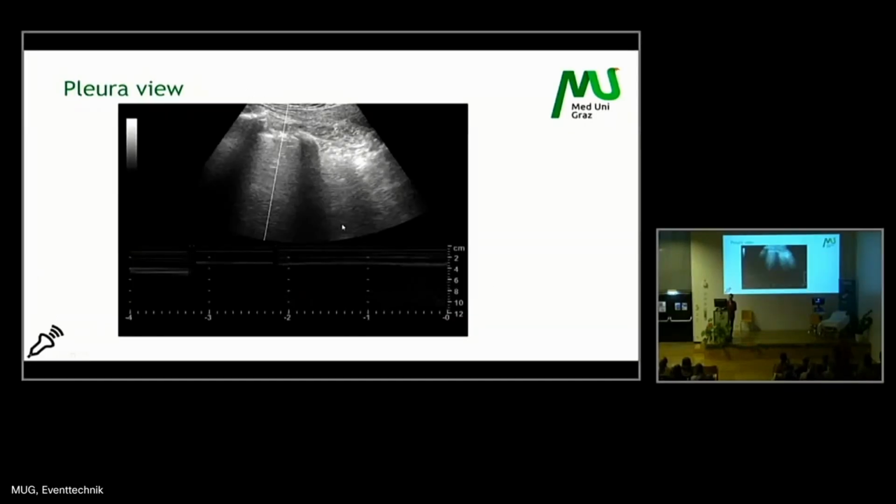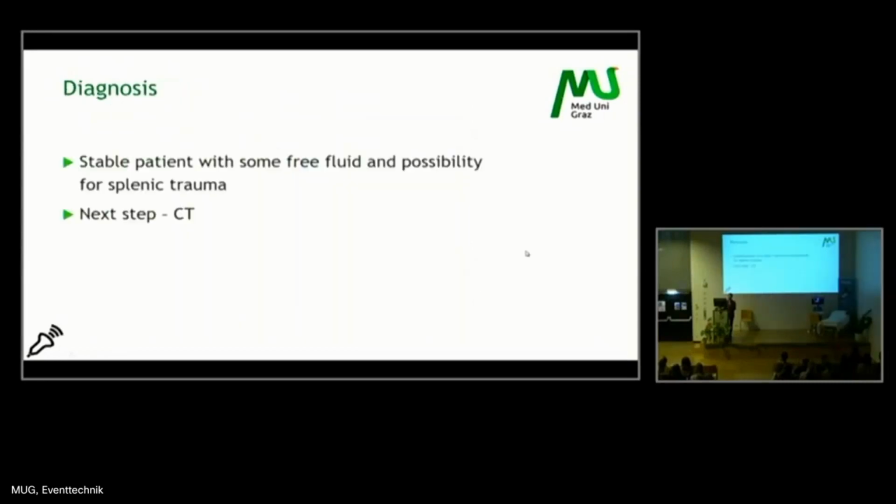The pleural view was nothing special. We see a seashore sign. I don't have a video, but there was a normal movement of the pleura. And our diagnosis was a positive eFAST, so we identified some free fluid.